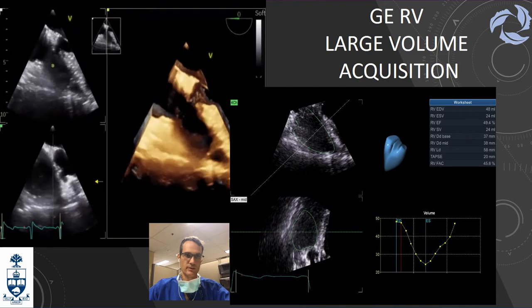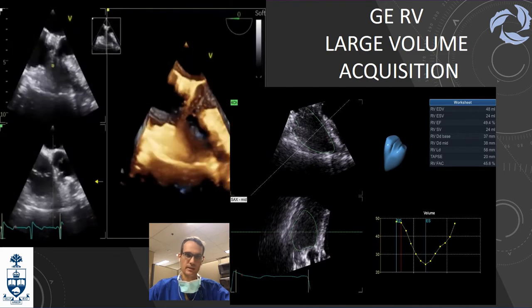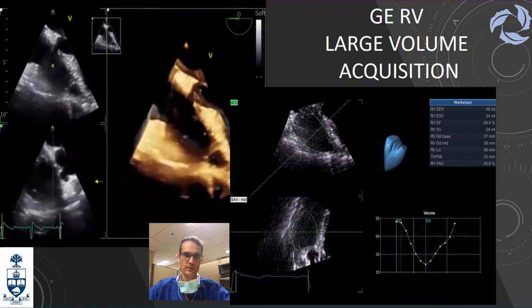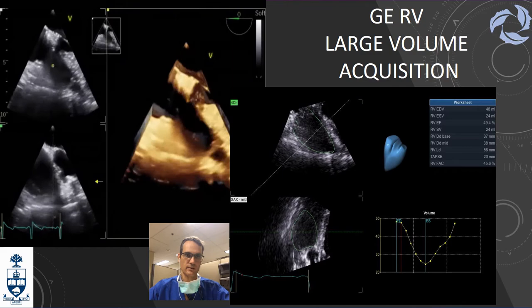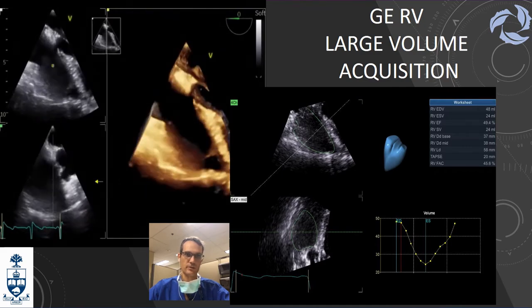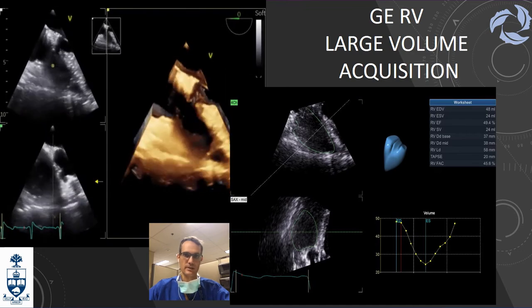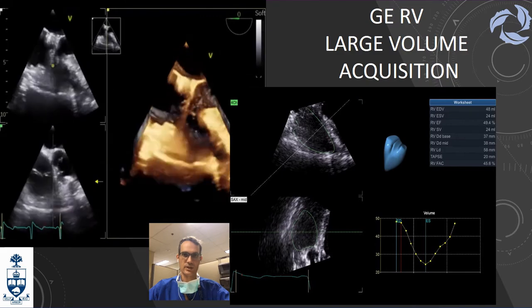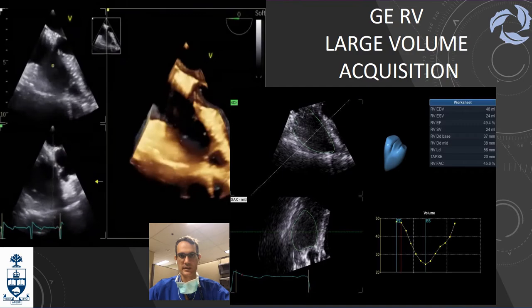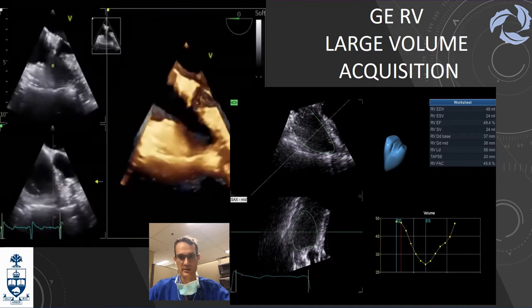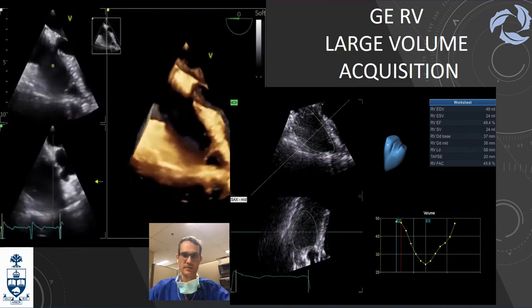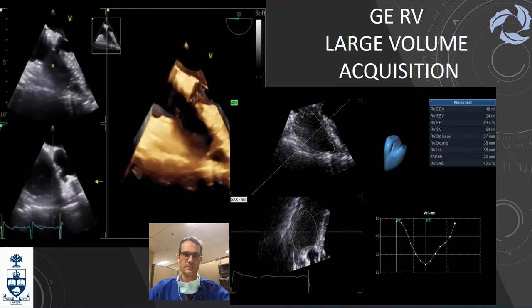For the right ventricle, GE has a contract with Tomtec. You can generate automatically in about 30 seconds — just positioning a few points — the diastolic and systolic volumes plus dimensions, which is very handy. Philips has also purchased Tomtec so we will probably be seeing that in new Philips machines very soon.